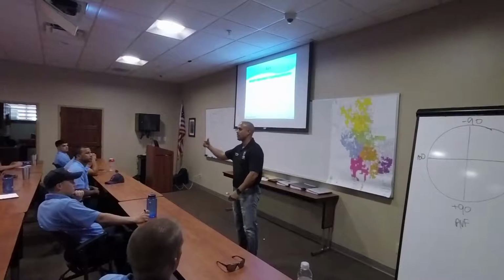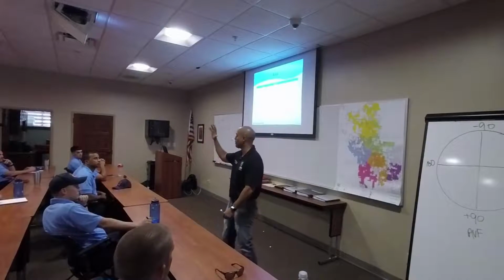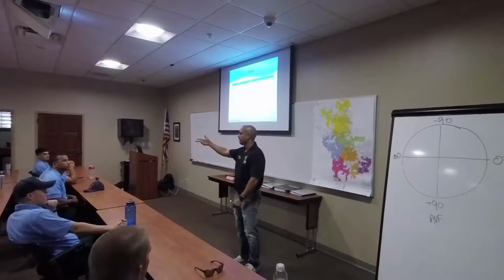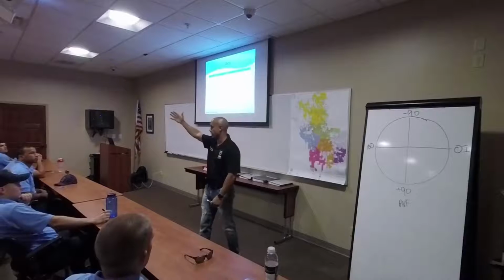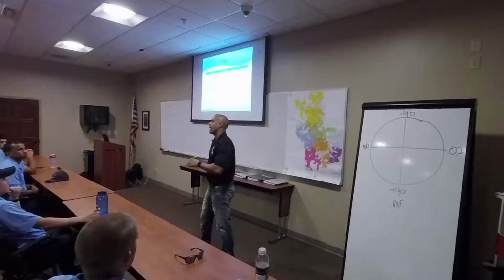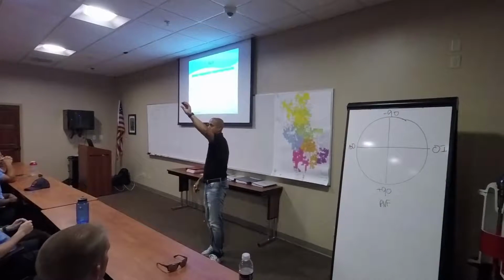So you can start seeing, as you start to treat your patient, your axis starts to change. It'll start to go normal. If it starts to shoot towards normal, are you doing what you're doing? Is it working? Yes, versus it's deviating even more, then it's not working, or it's increasing. So we're going to learn more about that as I go on to this. So that's one way to identify axis deviation, by using that degree right then and there.